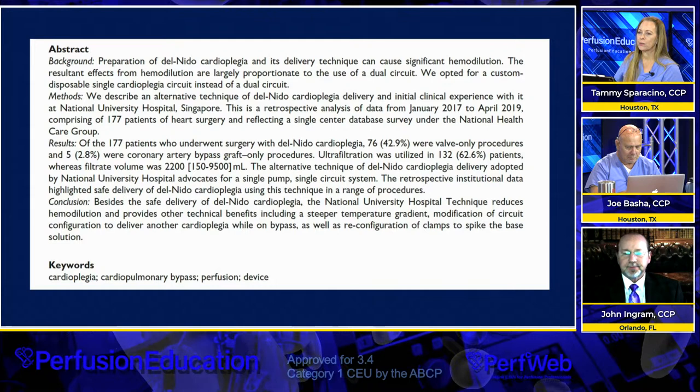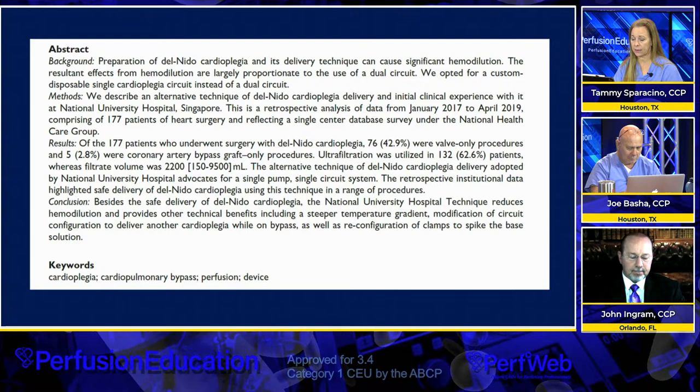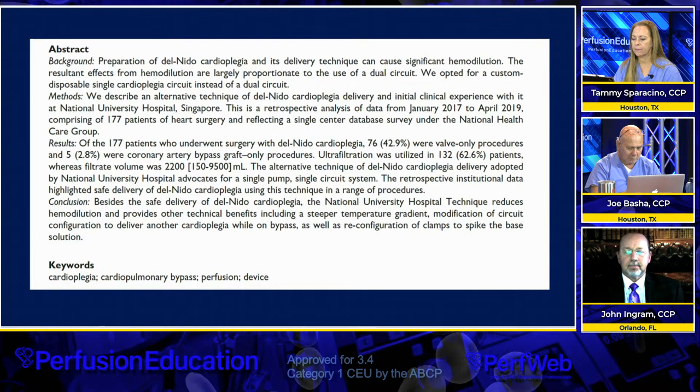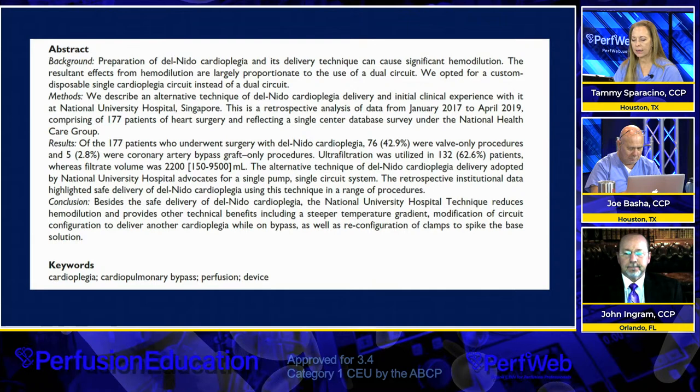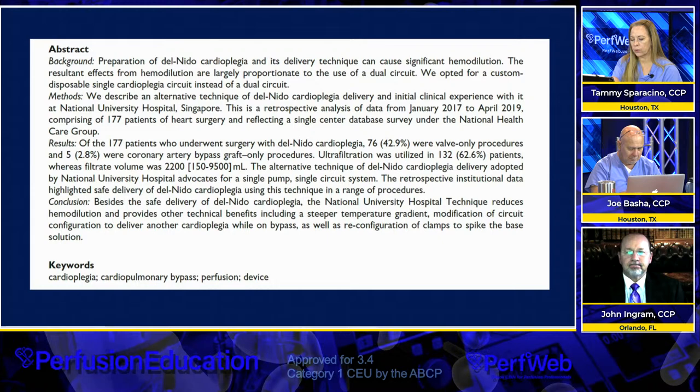Okay, let me just read the abstract to you. Background: the preparation of del-Nido cardioplegia and its delivery technique can cause significant hemodilution. The resultant effects from hemodilution are largely proportionate to the use of a dual circuit. We opted for a custom-disposable single cardioplegia circuit instead of a dual circuit. We'll get into their methods more as we go on, but I'll talk real quick about just the results so you can know where we're going with this.